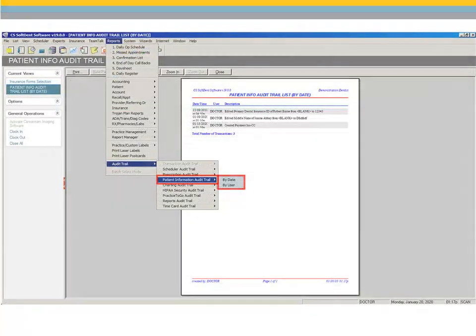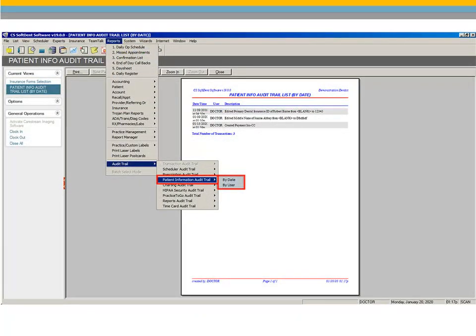Two Patient Information Audit Trail reports have been added to the Reports menu. The Patient Information Audit Trail by Date and Patient Information Audit Trail by User. These reports enable you to view and print lists of changes to patient demographic data by date or by user. Changes to clinical data are not included in these reports.